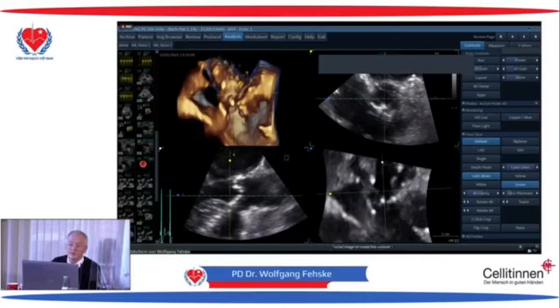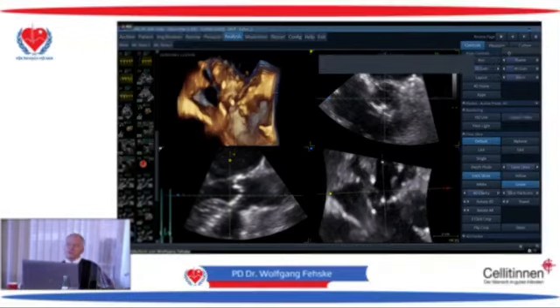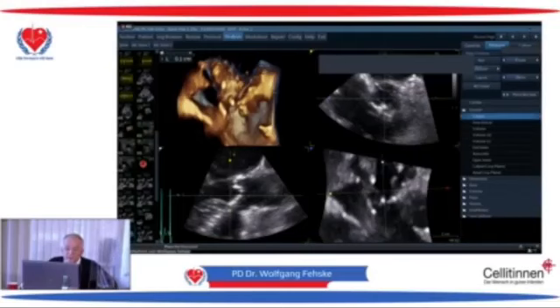This is the annulus. It is very difficult, and the guidelines do not look at all at these questions. It is extremely important what valve you put in this specific situation. You understand that? So yeah. We translate while I'm measuring.